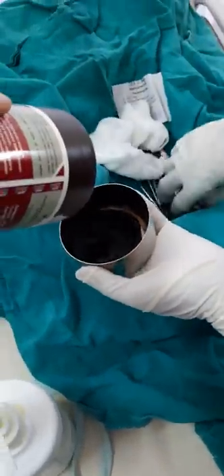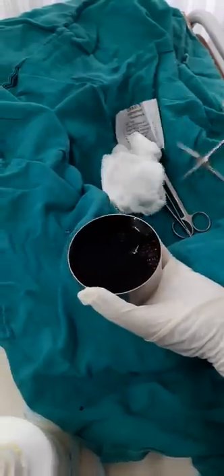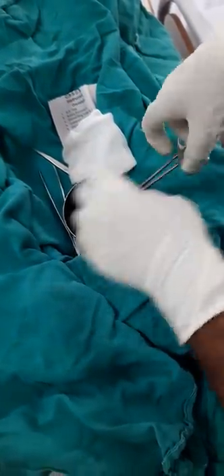The second step is opening the tray. This is the tray in which we will use the instruments. We will pour povidone-iodine into the bowl and use a sponge holding forceps. With the sponge holding forceps, we will now clean the area from center to periphery.